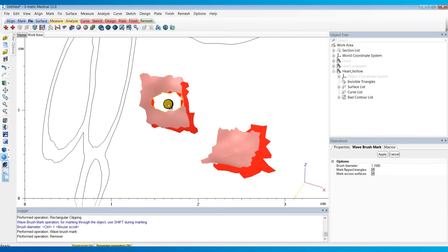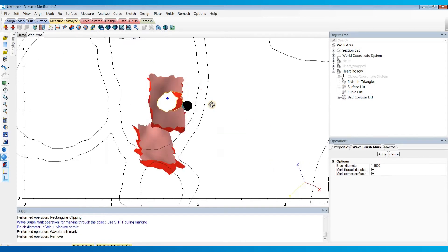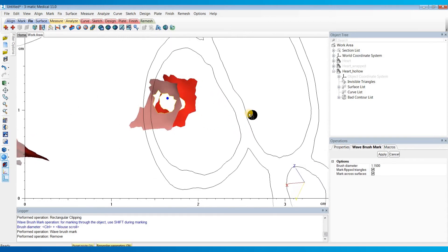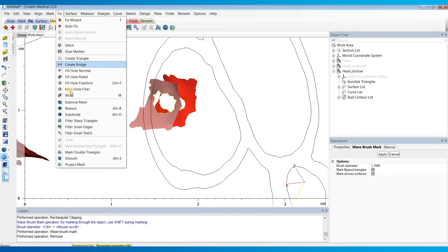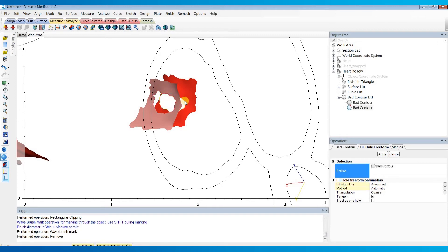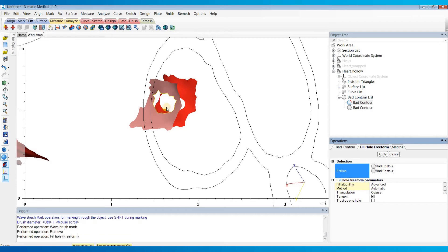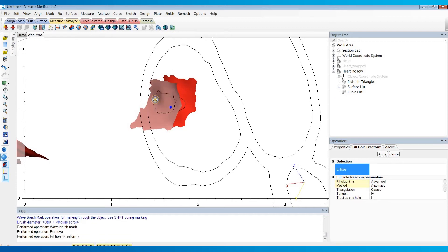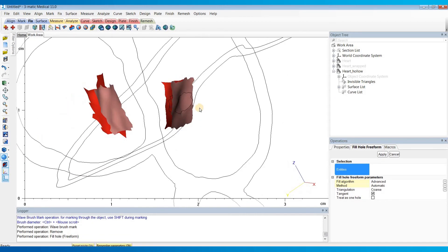Now after deleting those triangles, we have two holes left over. So to fill in those holes, I'll go to the fixed menu and choose fill hole free form. For our entities, I'll choose these outer contours of the holes, hit apply, and it'll fill in those holes for you.